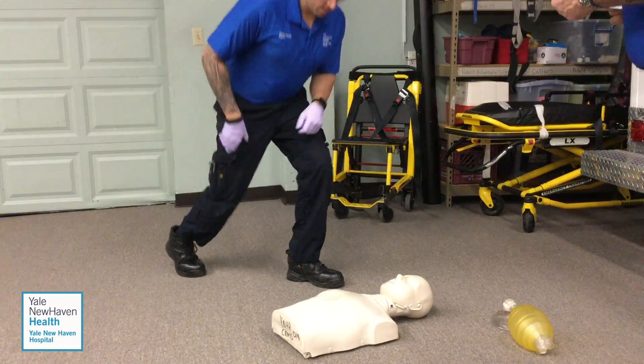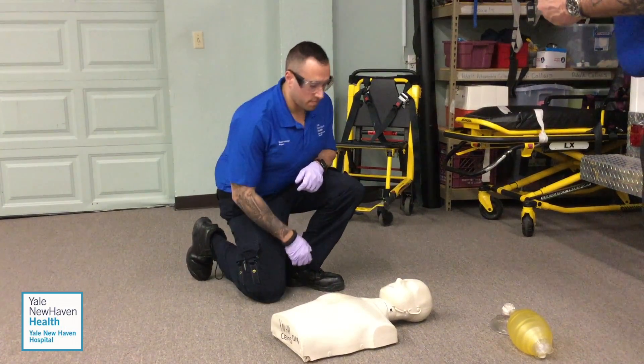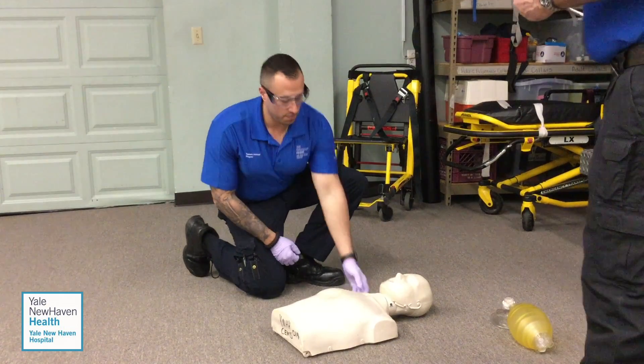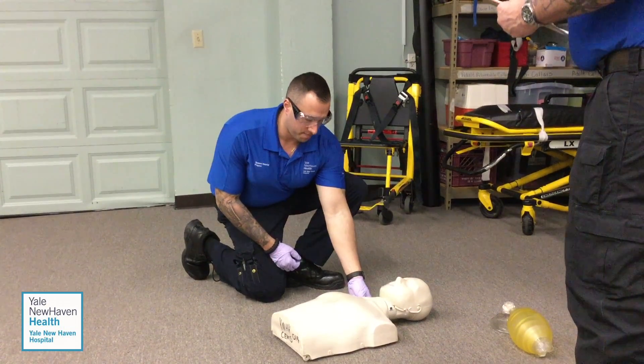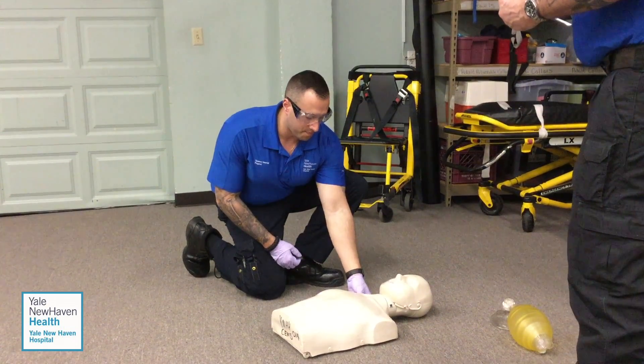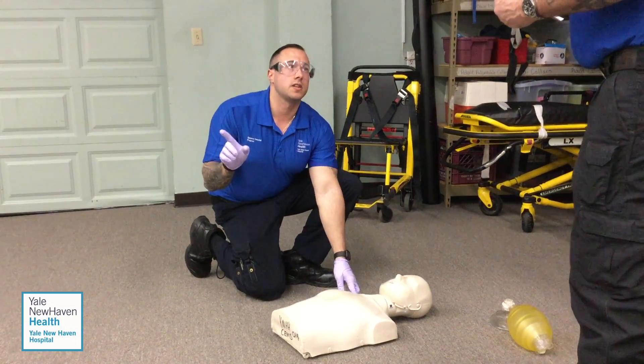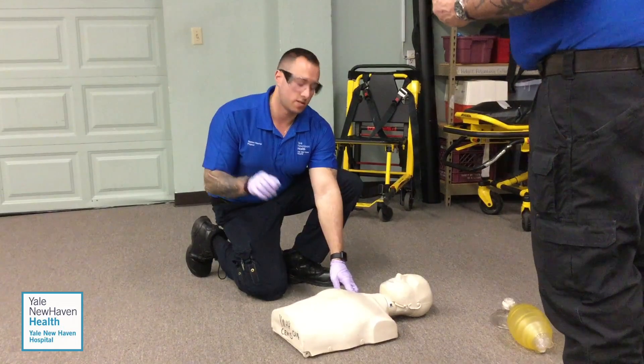Sir, can you hear me? No response. Painful stimuli? Nothing. I have my partner immediately go get the AED and I'll call for ALS.